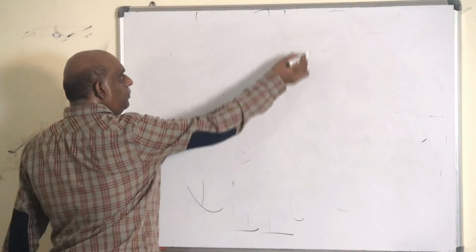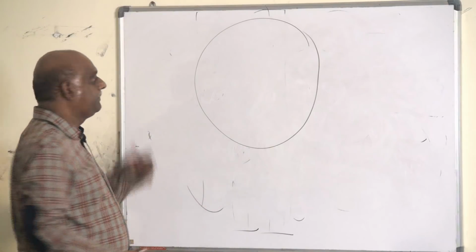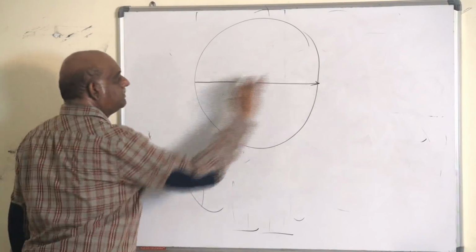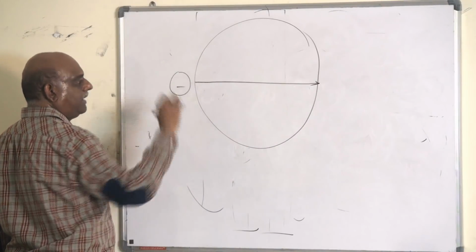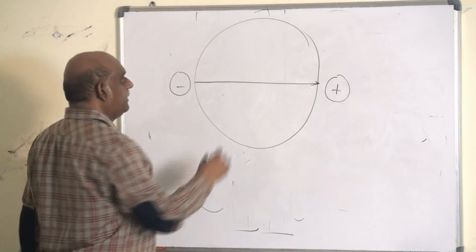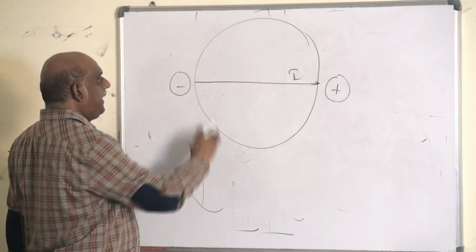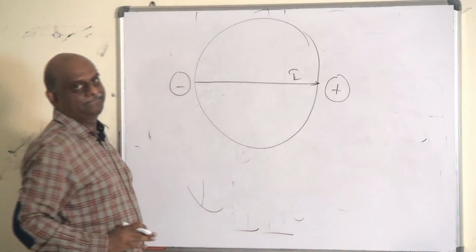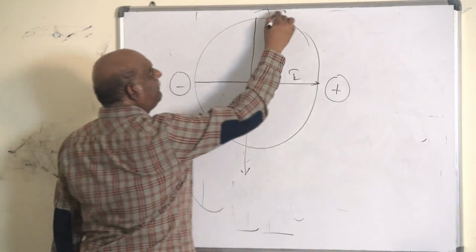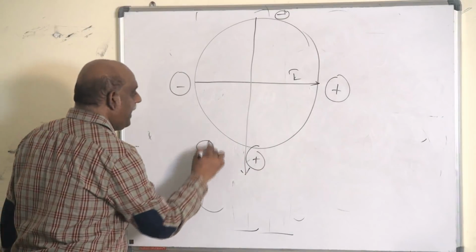If you consider the electrical axis as a circle, what is that lead which goes straight from the right side towards the left side, doctor? It is lead 1. So lead 1 represents the equator. And which is that which comes straight from above to below, where it is negative above and positive below? It is AVF.